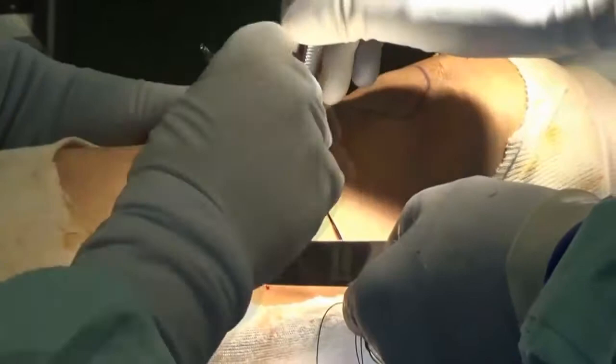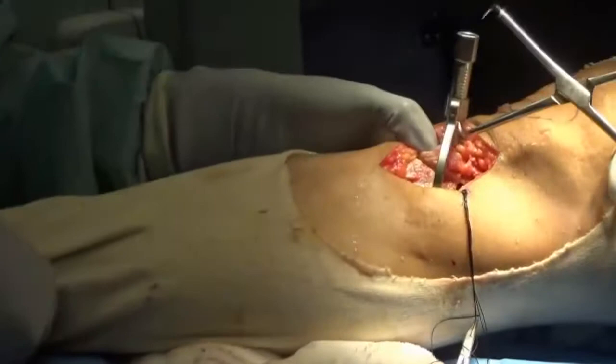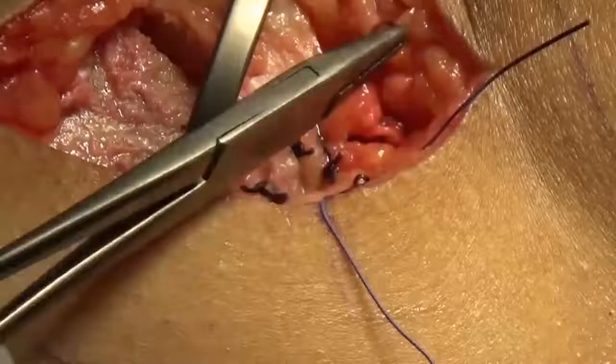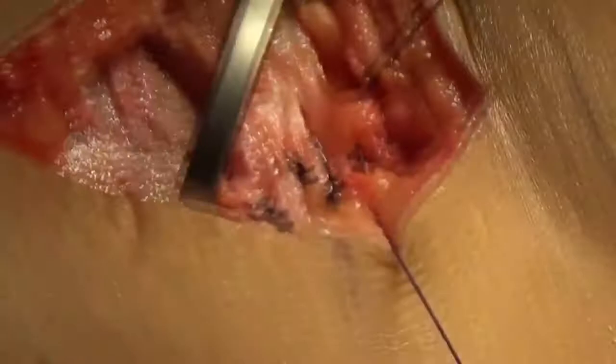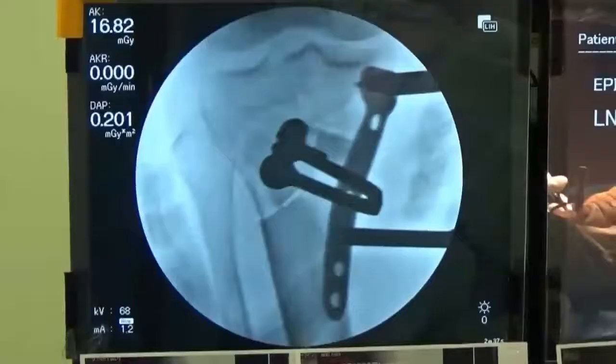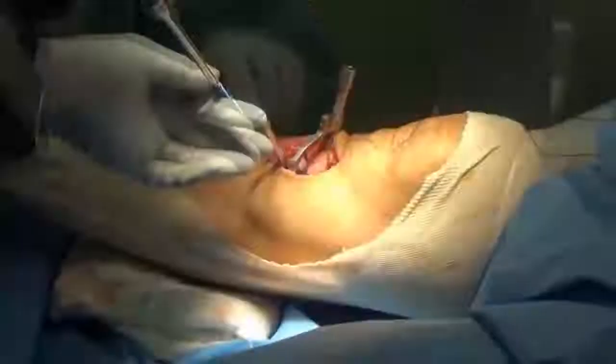Using a tuberosity screw device of our own design for OWDTO, compression of the interface of the descending osteotomy surface is performed. The reflected inverted T-shaped flaps are then sutured and secured to each other over the osteotomy gap. Fixation using a locking plate and eight screws is then performed on the medial side of the tibia.